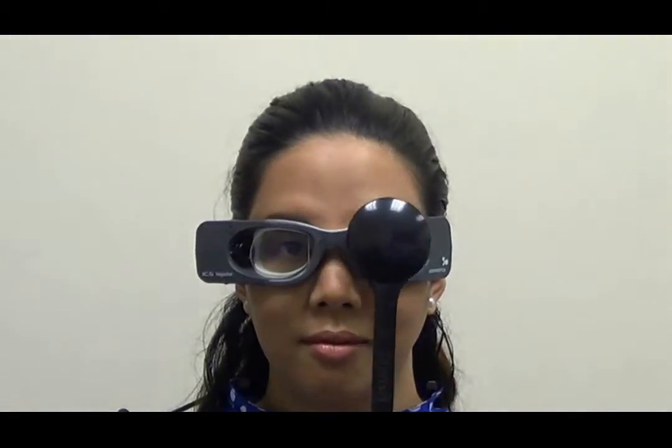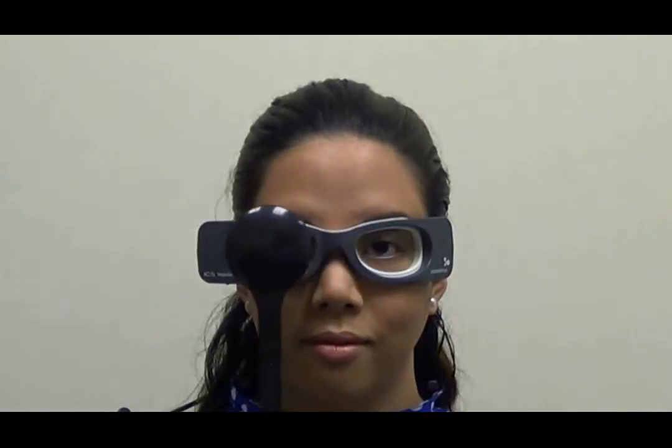When performing the skew deviation test, you must make sure that you're moving the ocular occluder quickly between the eyes across the nose. Always start on the right side because the first click for cover is going to be covering the right eye. And so if you're using your remote or pushing the button on the software, make sure you always start by covering the right eye.